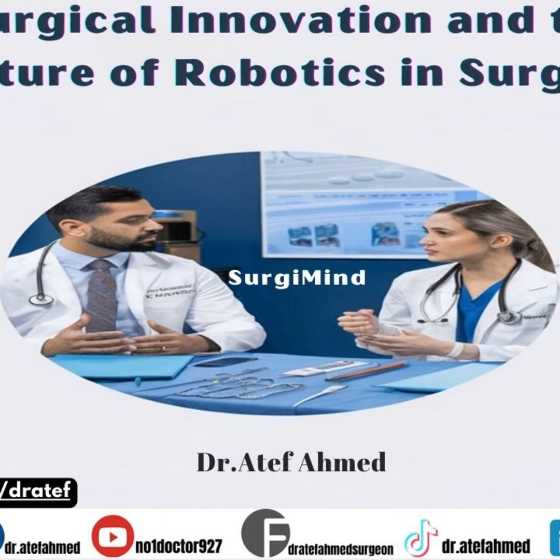Oh, it is. I mean, just picture this. You've got these robotic arms, right? And they've got these incredibly fine instruments, way more precise than anything a human hand could manage. And the surgeon is right there, but they're controlling these arms from a console. They've got this magnified 3D view of everything, so it's like they're right inside the surgical field.